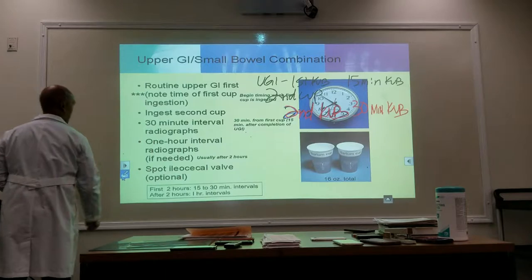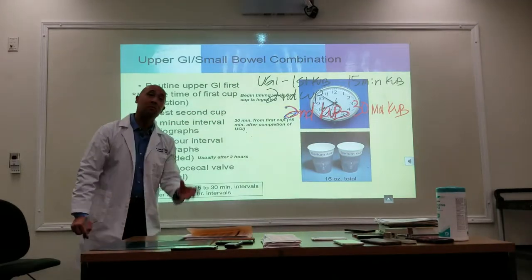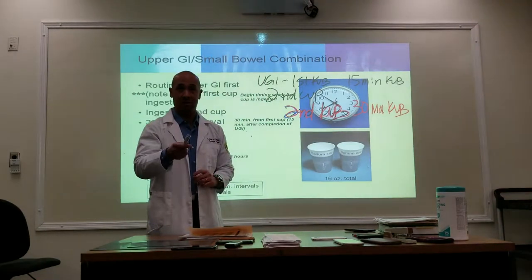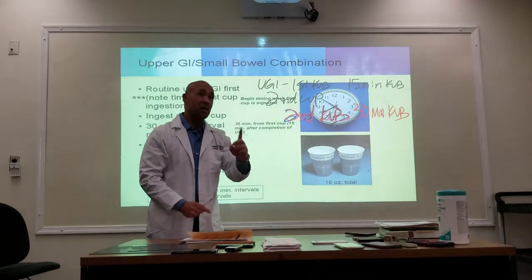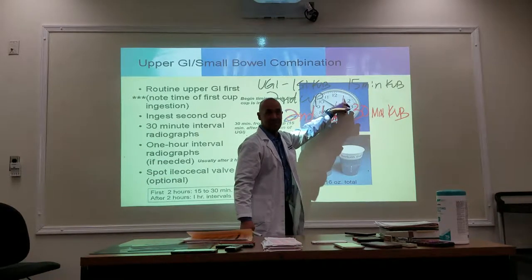So it's 30 minutes, because it counts from the very first cup. We're timing it from the very first time. The moment they start drinking their first cup, it takes about 15 minutes to do the upper GI procedure, the doctor's part. So now that the doctor is done, we take our overheads, and when we start taking our overheads, we're about 15 minutes in. Does that make sense, guys?